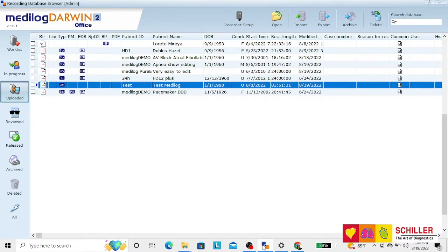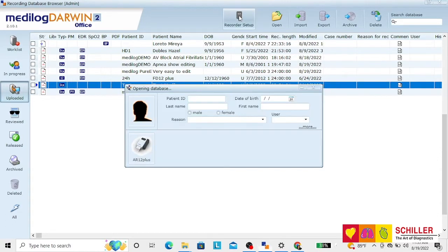Medilog Darwin. Starting a recording through the computer. On the top of the screen you have the icon of recorder setup. Click there.